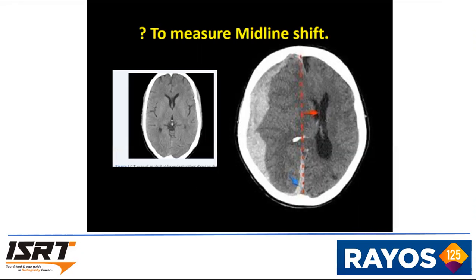And that is how we can calculate or draw a midline shift. The normal brain has two equal halves on either side. When one side pushes the other due to some reasons, like traumatic brain injury or any underlying pathology, the center will be shifted to the other side. Here you should know how to take the midline shift, the extent of shift towards either side.